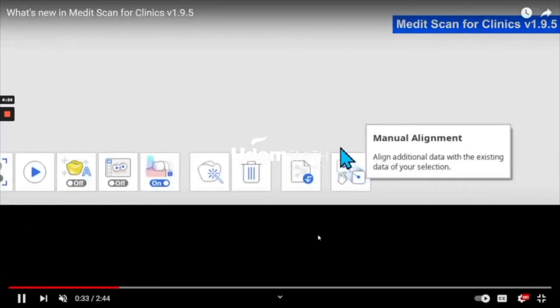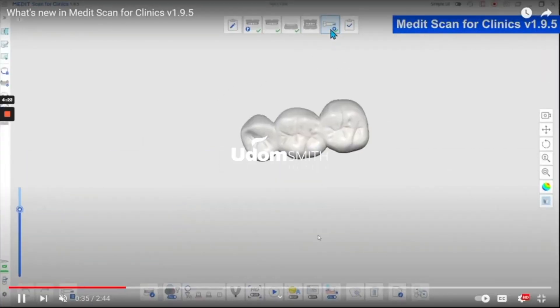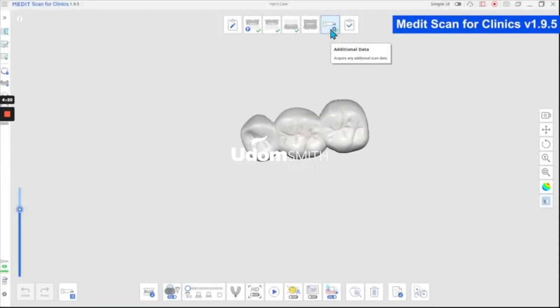Hello everyone. We will see the manual alignment and replicate the existing data on the screen.